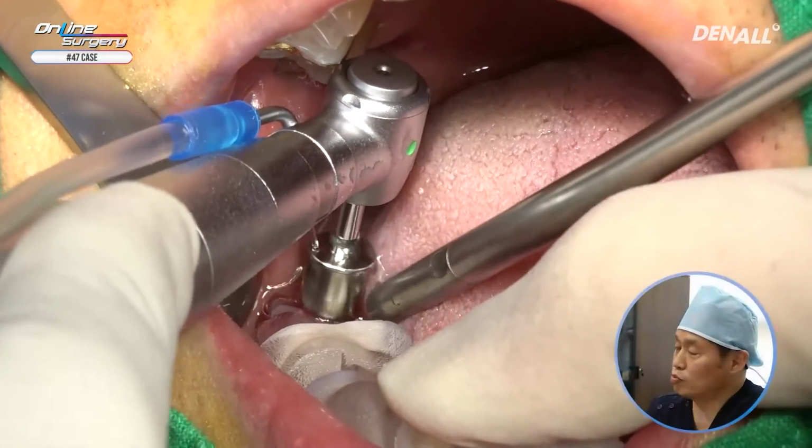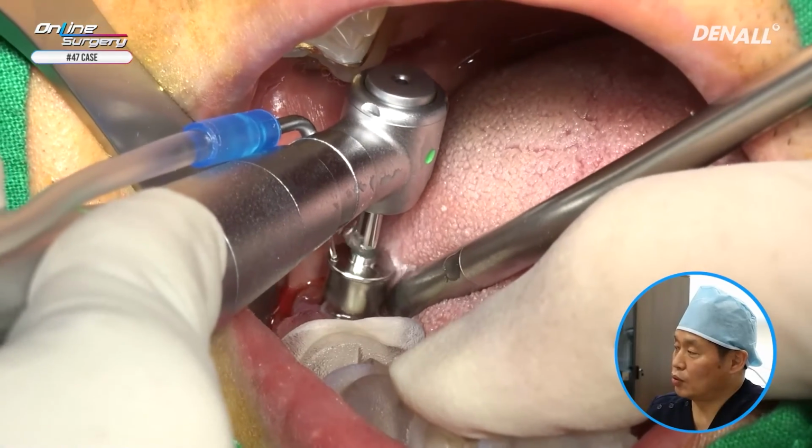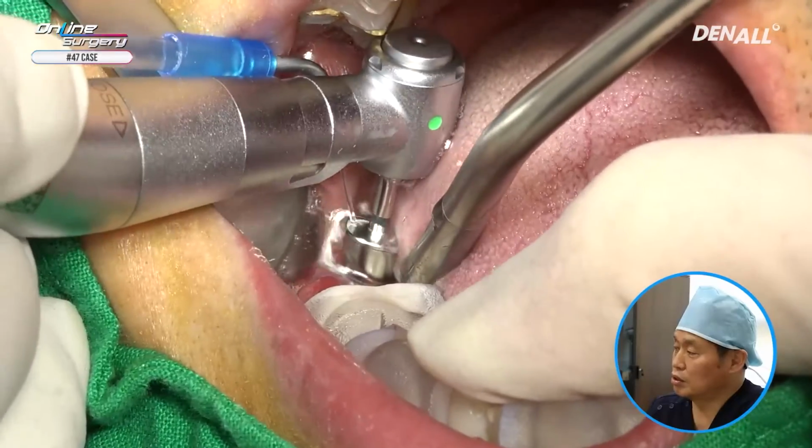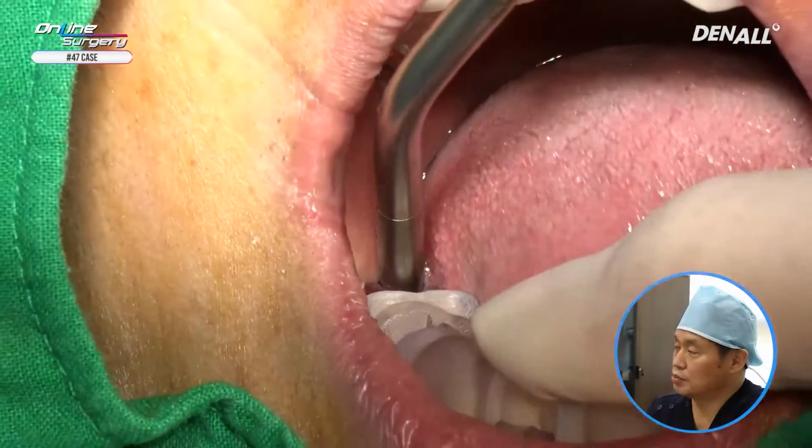Open your mouth wider. In the case of most distal tooth, at times it can be difficult to find the path, so you need to pay more attention to it.